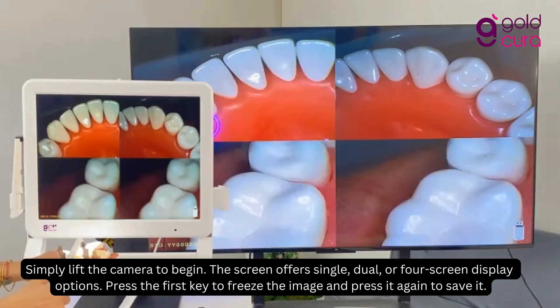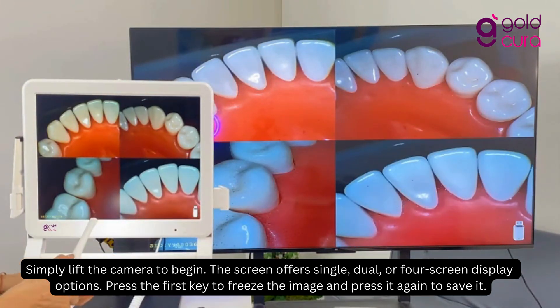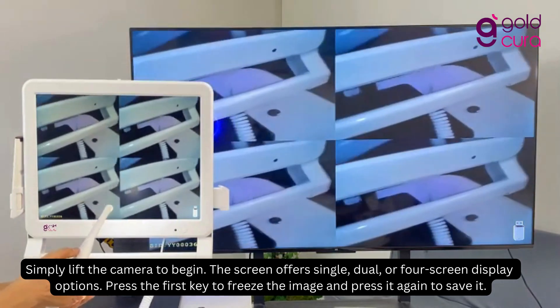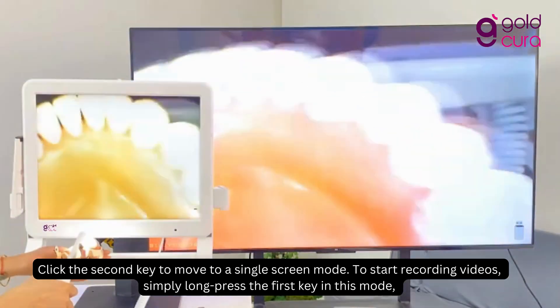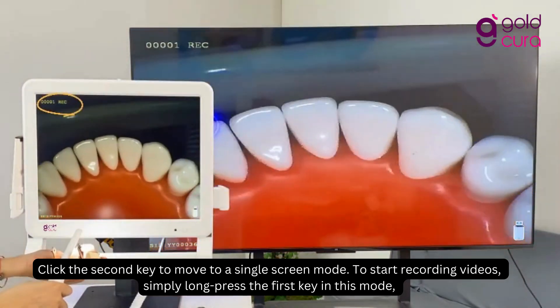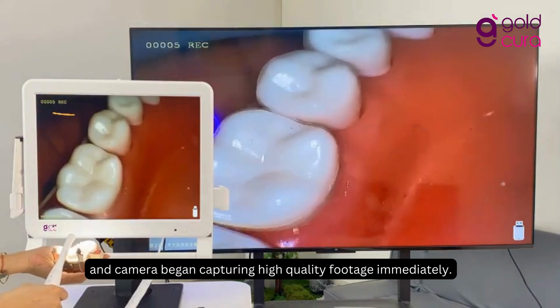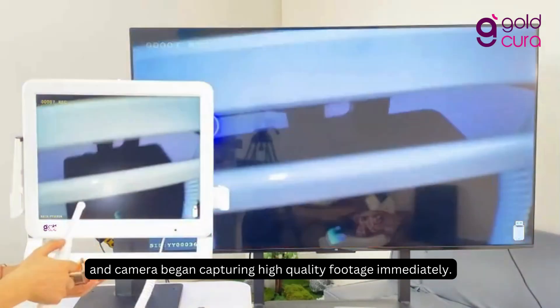Simply lift the camera to begin. The screen offers single, dual, or four-screen display options. Press the first key to freeze the image and press it again to save it. Click the second key to move to single-screen mode. To start recording videos, simply long-press the first key in this mode, and the camera will begin capturing high-quality footage immediately.